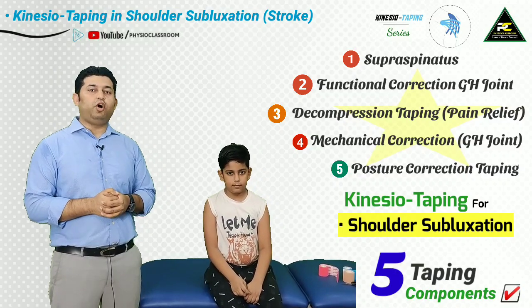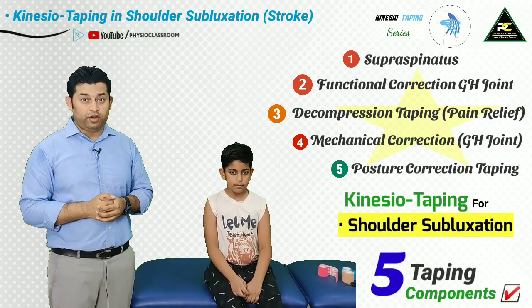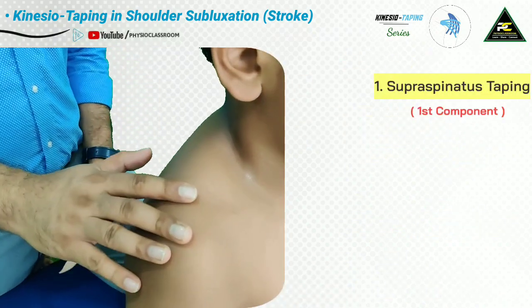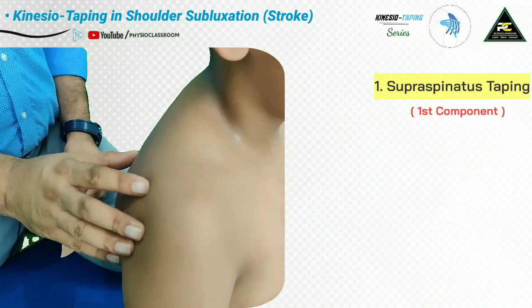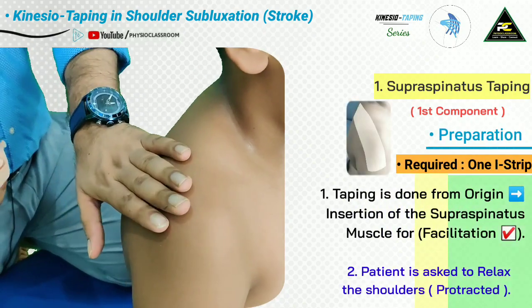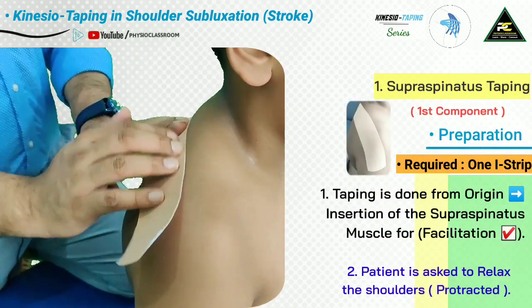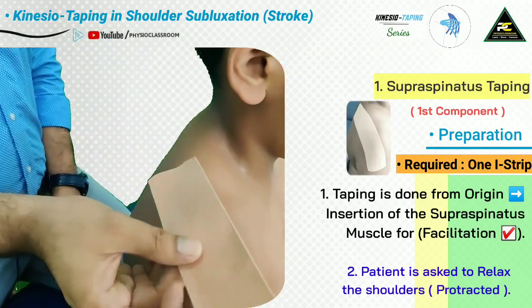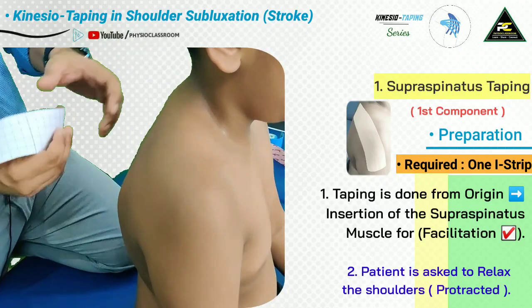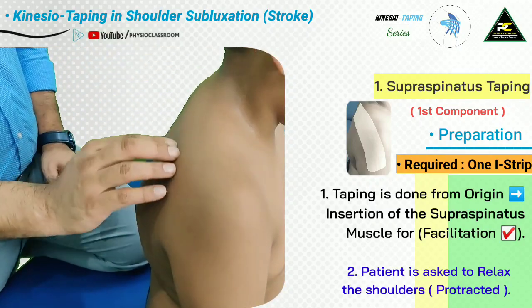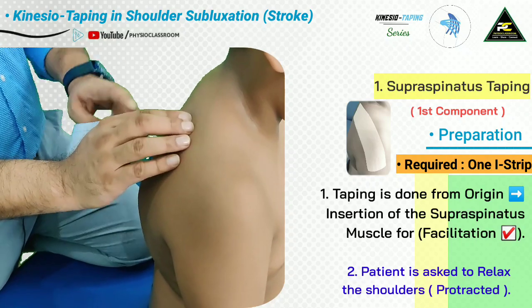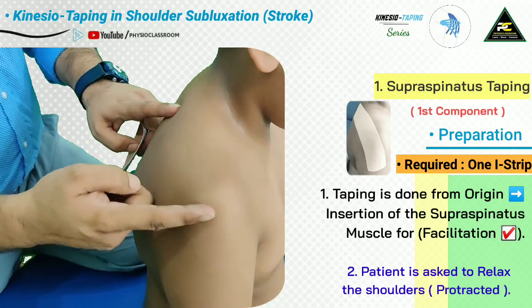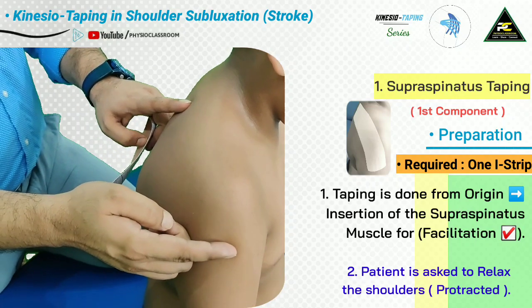Let's get started with the practical demonstration of the kinesio taping technique for hemiplegic shoulder pain and subluxation. In this example, we are going to tape the right side shoulder joint. The first taping is for activation or support of the supraspinatus muscle. For this, I have prepared an I-strip that is going to be applied over the spine of the scapula where the supraspinatus originates, with the strip placed distal to the glenohumeral joint by at least one to two inches.